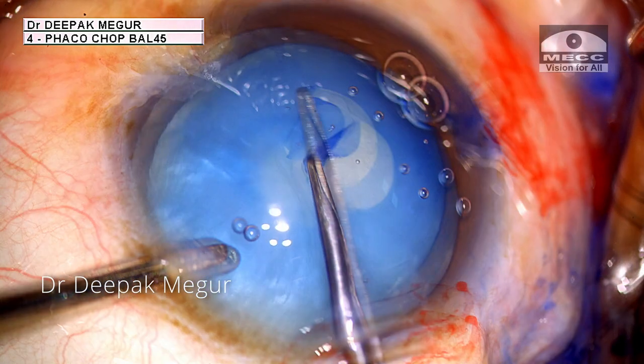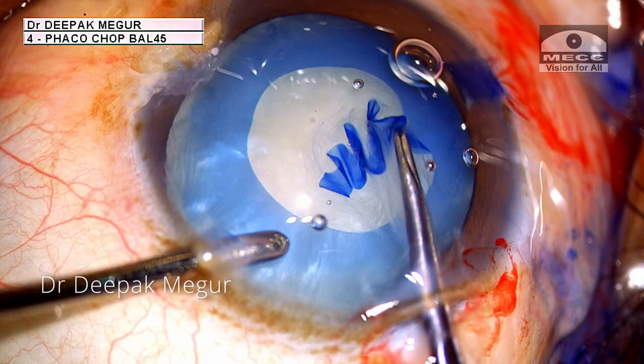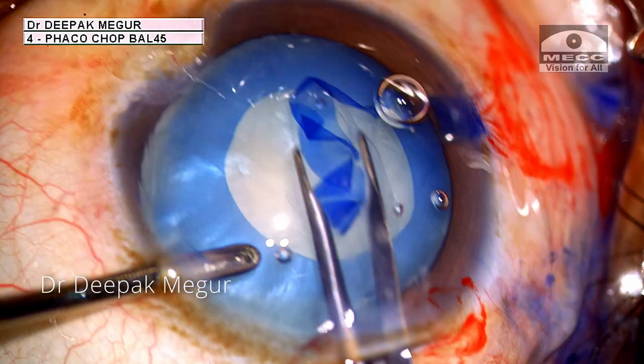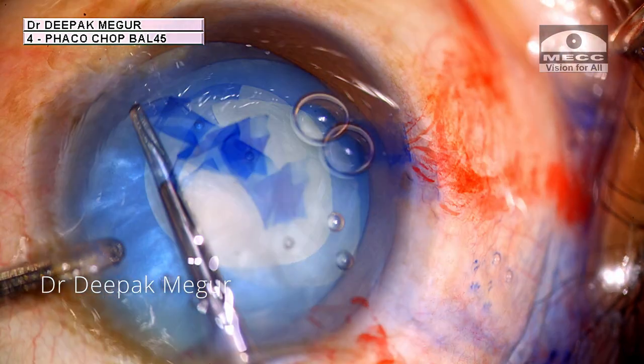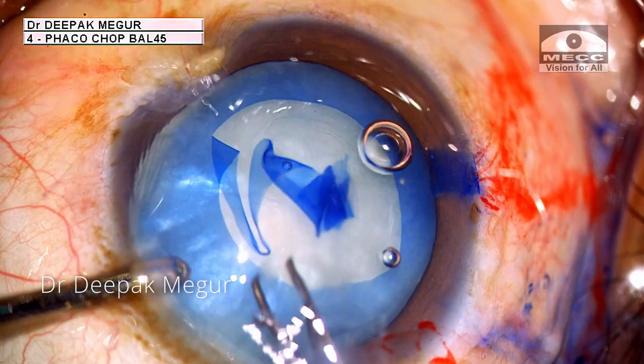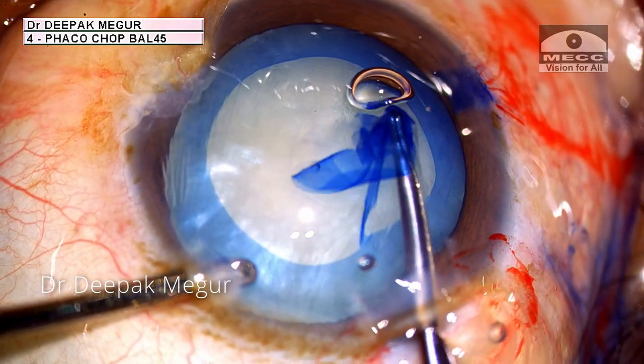The principle of this technique is that we start off with the goal of doing a smaller rhexis initially. And as we are about to reach the endpoint, we extend it using the thin remaining flap. This spiraling or whirling is continued until we have the desired size of the capsular opening.